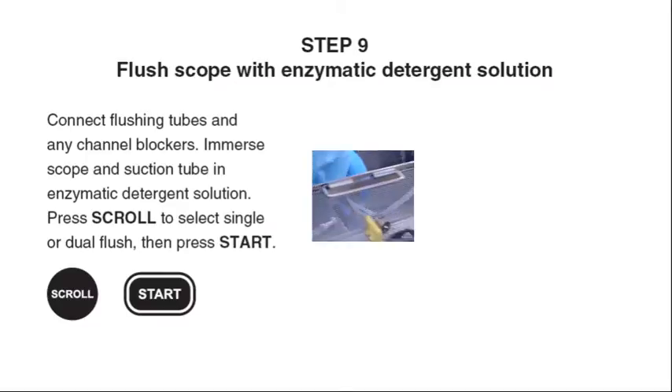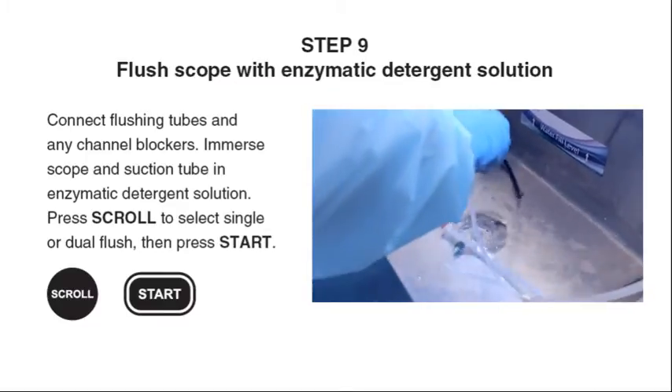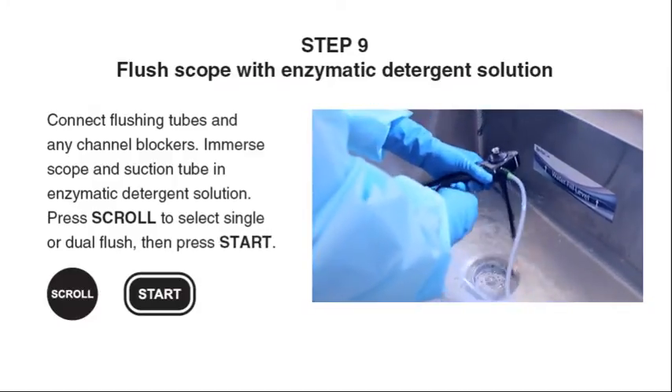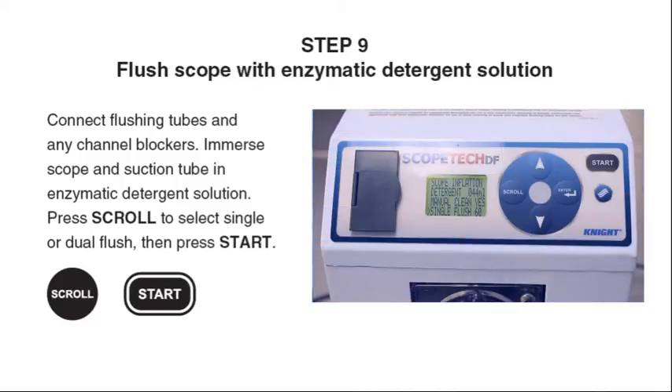Step 9: Connect flushing tubes and any channel blockers. Immerse the scope and suction tube in the enzymatic detergent solution. Press scroll to select single or dual flush, then press Start to flush the channels.